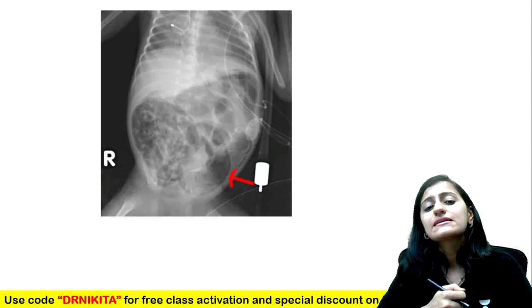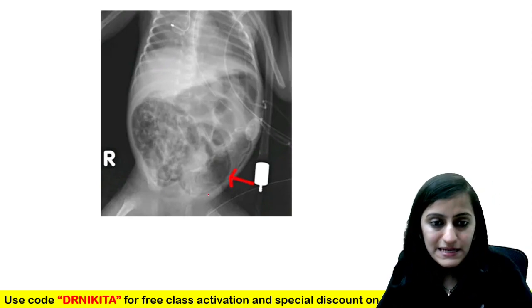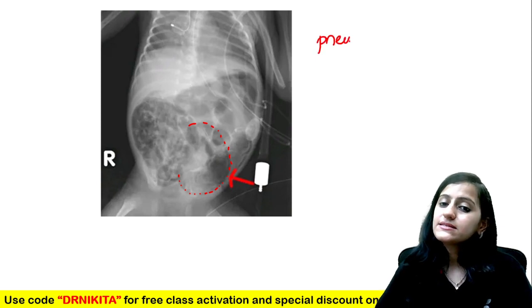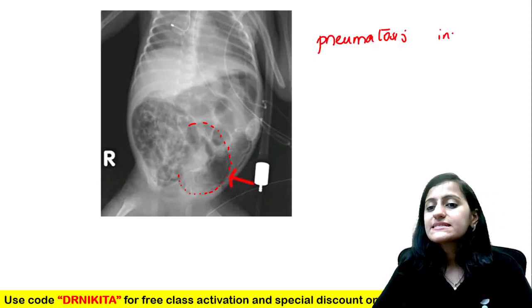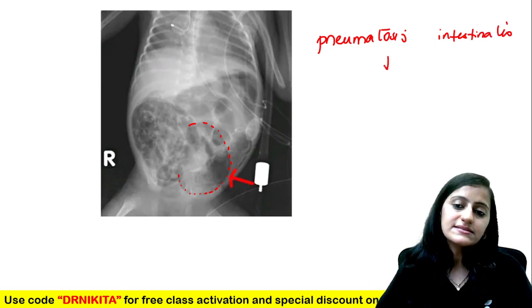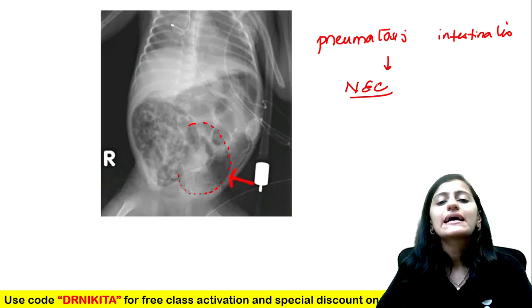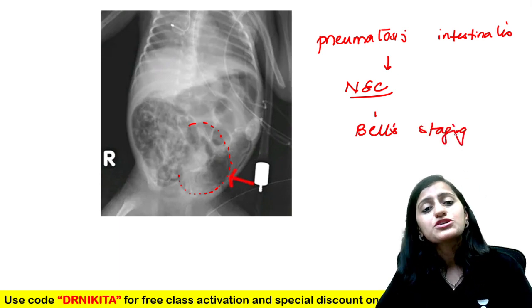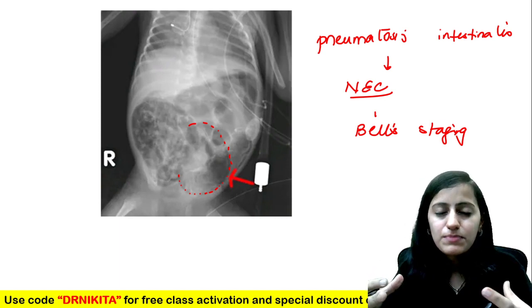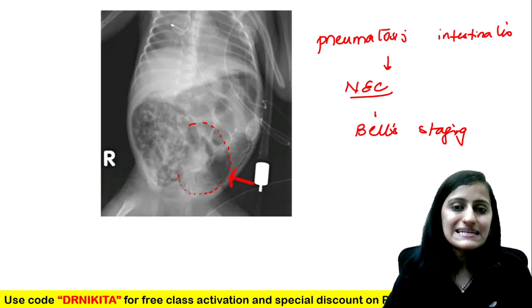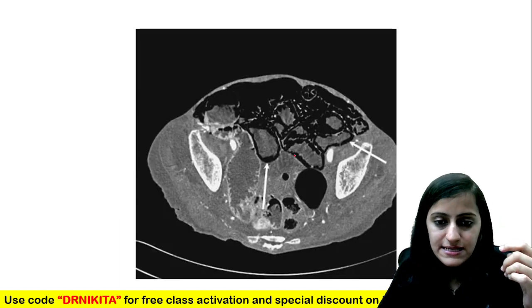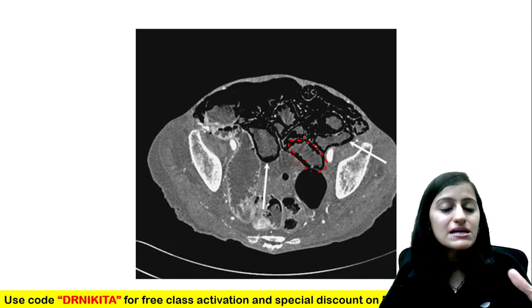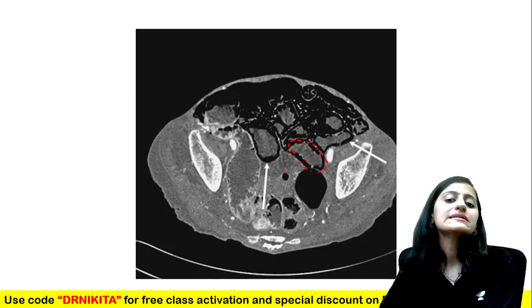In this child, air is seen outlining the bowel wall — black air outlining the bowel loop. This is pneumatosis intestinalis — air in the bowel wall — which can be seen in necrotizing enterocolitis (NEC). Bell's staging is used for NEC. This is the ischemic, gangrenous bowel leading to air formation — pneumatosis intestinalis. On CT in this patient, air is seen all around the bowel in the bowel wall, confirming ischemia leading to gangrene and gas formation.